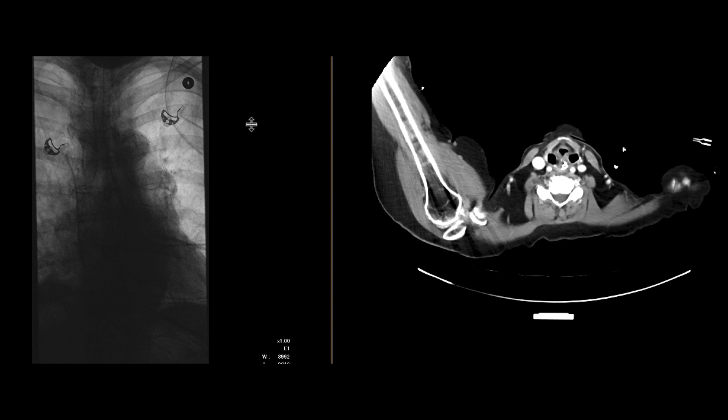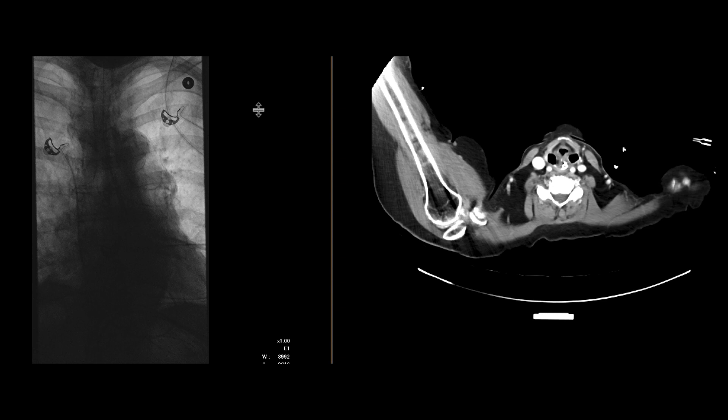This is a patient who had some chest pain, and a chest x-ray suggested pneumomediastinum and a pneumothorax. The team was worried about esophageal perforation, and an esophagram was performed.